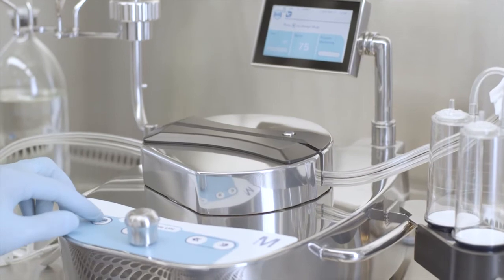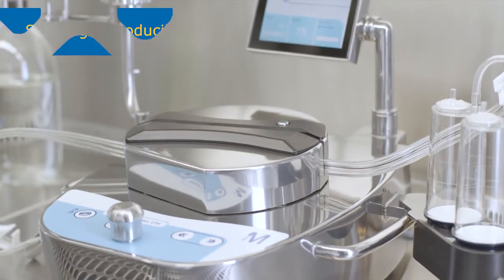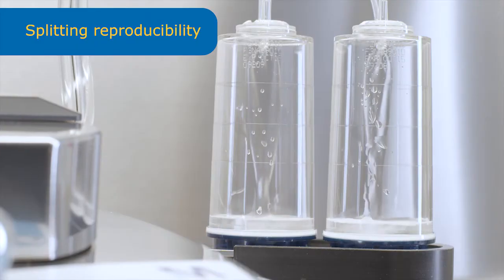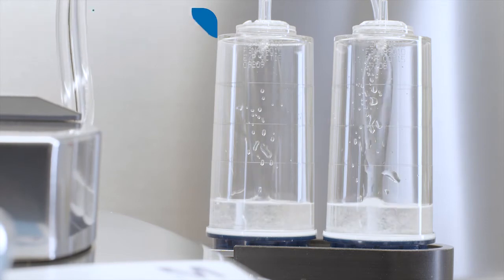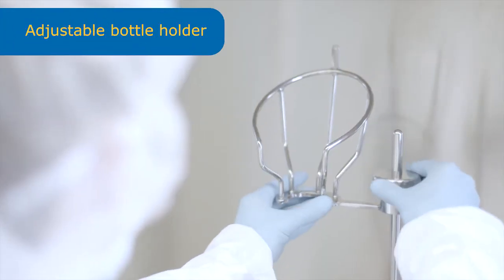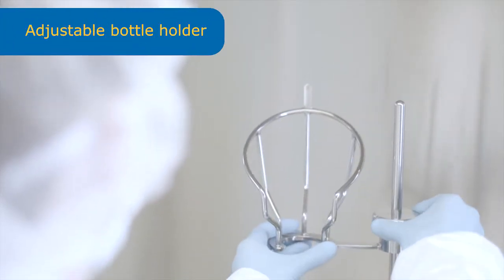The automatic closure eliminates the risk of glove pinching and ensures reliable splitting of the liquid sample. You can also adjust the height and angular position of up to two liter bottles.